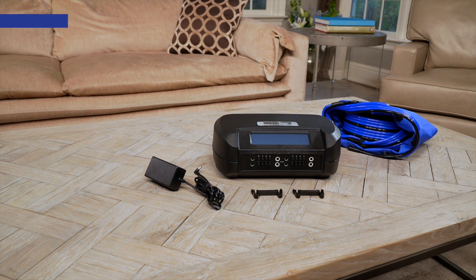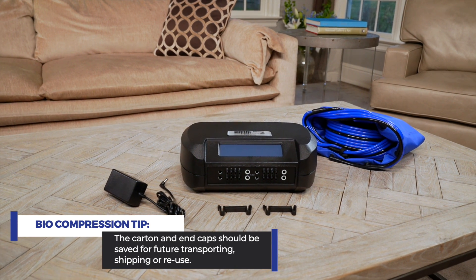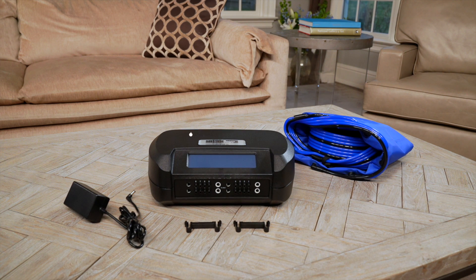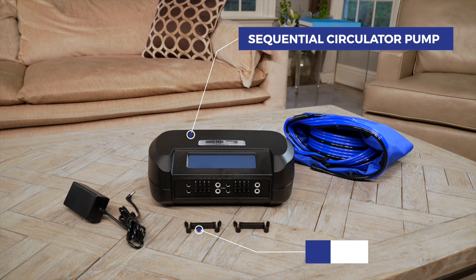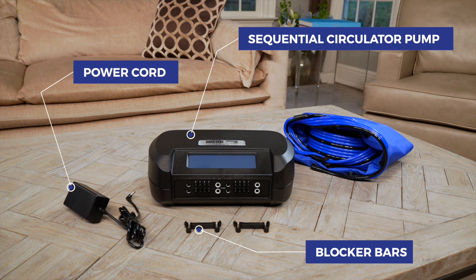First, unpack your biocompression pump and take out all of the components. The carton and end caps should be saved for future transporting, shipping, or reuse. Make sure you have the following items in the box: a sequential circulator pump, blocker bars for use during single garment therapy, a power cord, and an instruction guide.